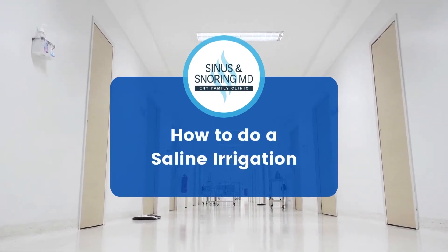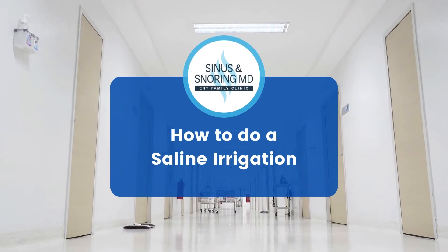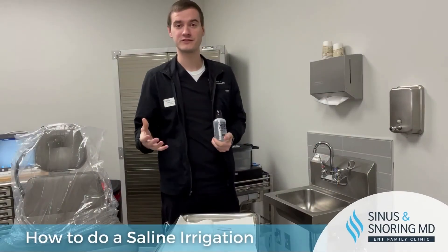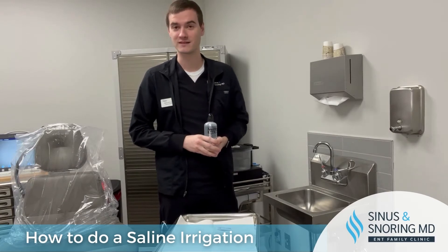Today we're going to go over how to do a saline irrigation using the NeilMed sinus rinse. Following procedures, we have almost every single patient doing nasal irrigations at least twice a day.